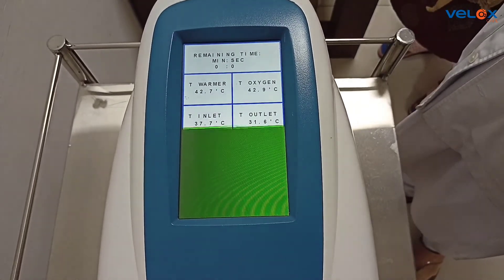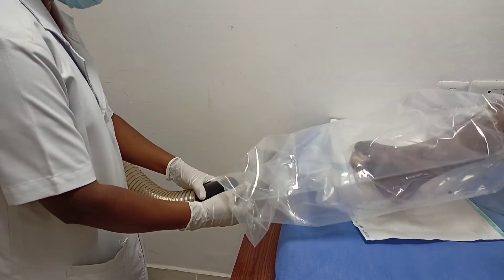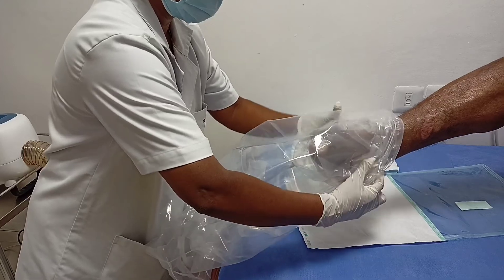After 90 minutes, therapy gets completed. Disconnect the bag from the warmer. Remove the therapy bag from the patient's limb.